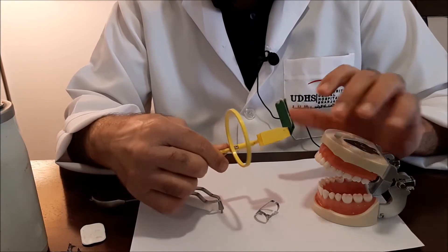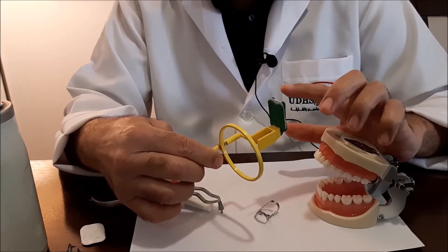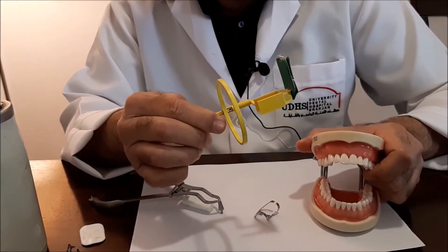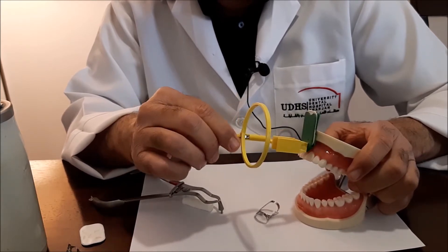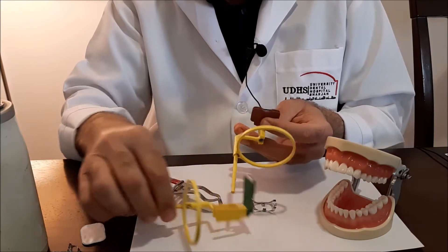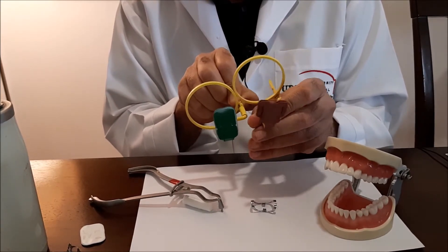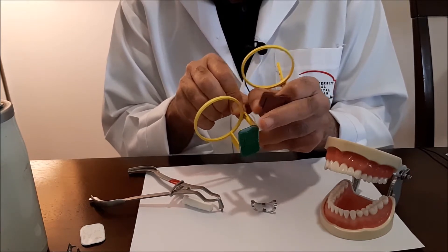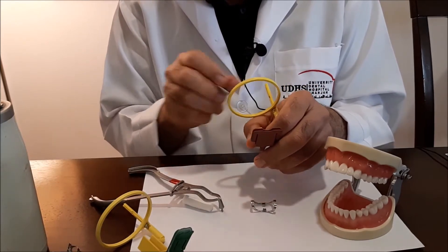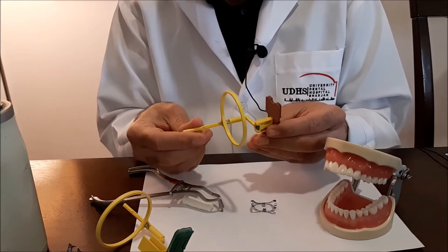The next section covers posterior teeth. Unlike anterior teeth, you cannot take a radiograph on posterior teeth using the vertical sensor holder, as that is meant for upper and lower anterior teeth. For posterior teeth, the film must be placed in a horizontal direction. While anterior teeth use vertical film placement, posterior teeth use horizontal placement because the roots of upper and lower posterior teeth are shorter in dimension.